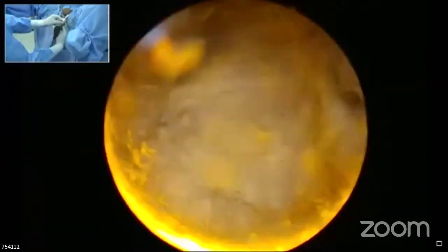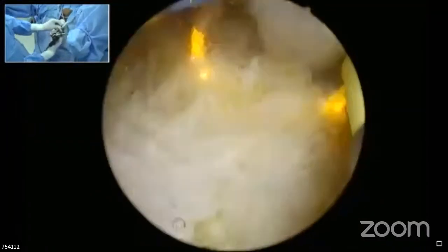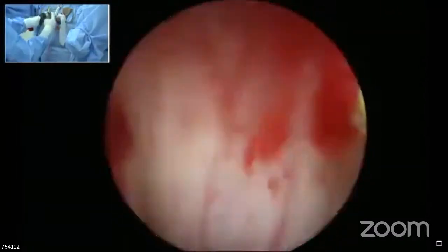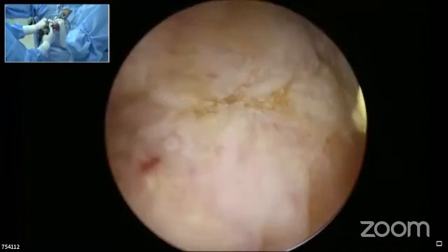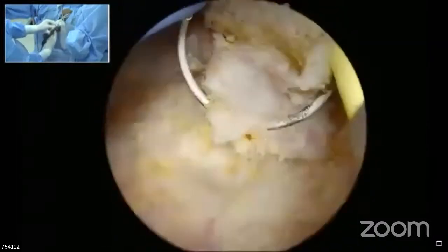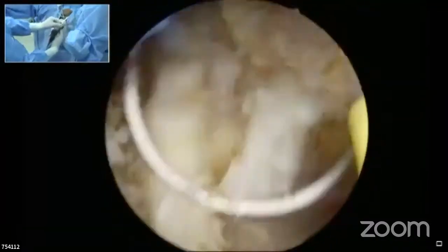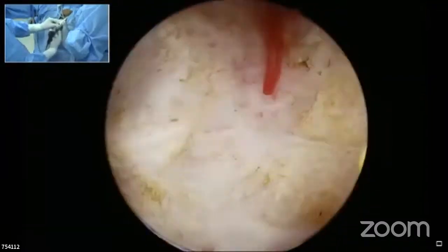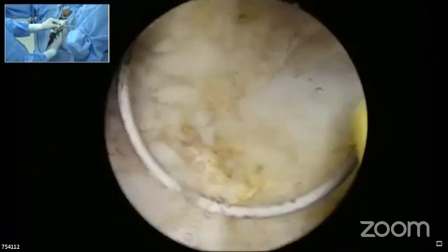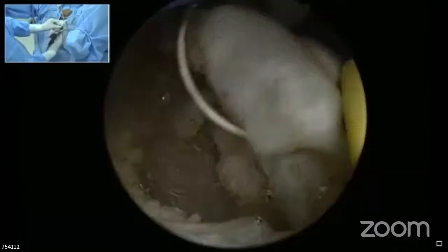And that's why this entire lobe is avascular. Yes, sir. We evolved this thing basically from what modification we were trying to do with our TUEB technique, bipolar enucleation, where we were separating it from all around and keeping it attached at the verumontanum. And eventually resecting it in fossa. So eventually we realized that what we can do with the bipolar enucleation cannula, spatula, we can do the same thing with the resection loop as well. So this is basically a replication of the same principle in a resecting manner.